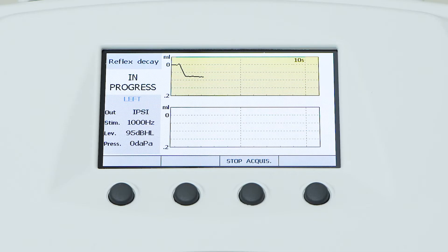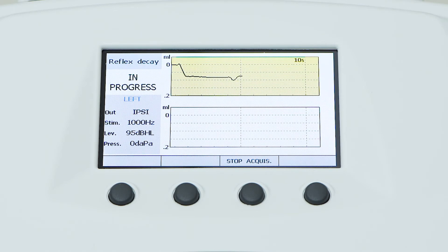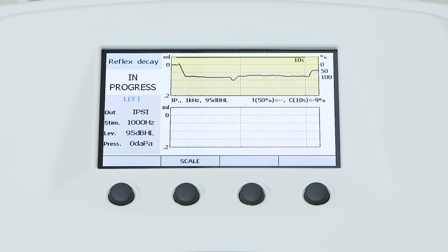Once the exam is completed, just below the graph, the test results will be shown, including the timings of activation and deactivation of the acoustic reflex.